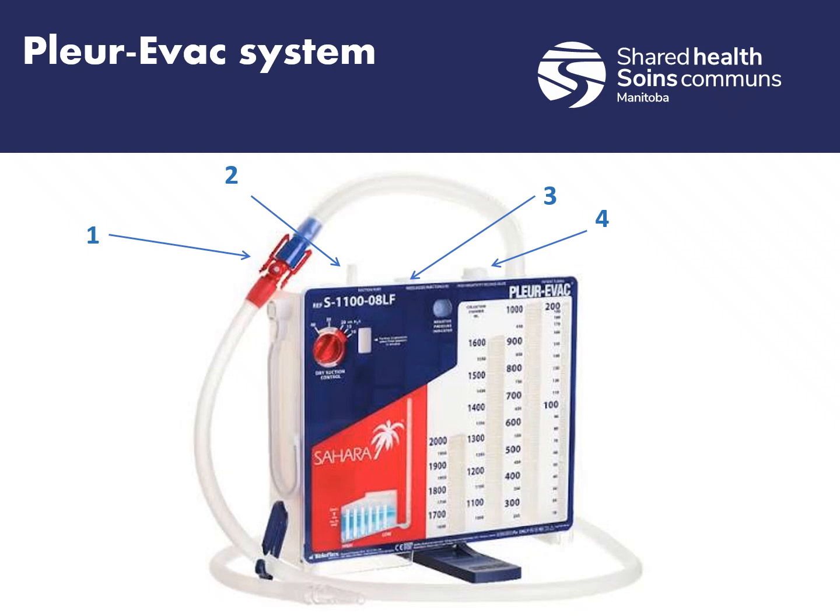So this part here is the filtered high negativity relief valve. I strongly recommend you do not touch this. It manually vents excessive negativity by briefly depressing the button to allow filtered air to enter the unit. We don't touch this unless it's requested by the physician or the staff at the facility.